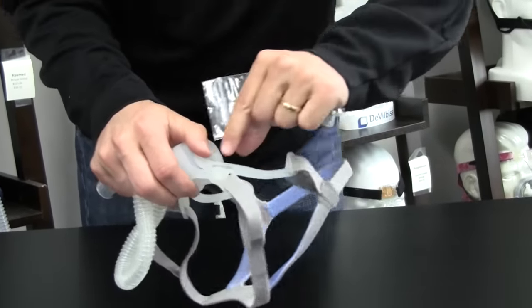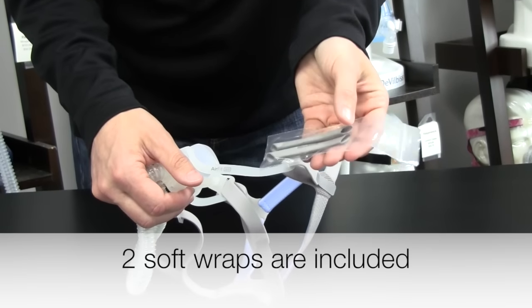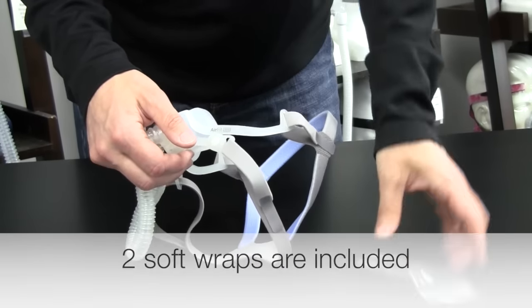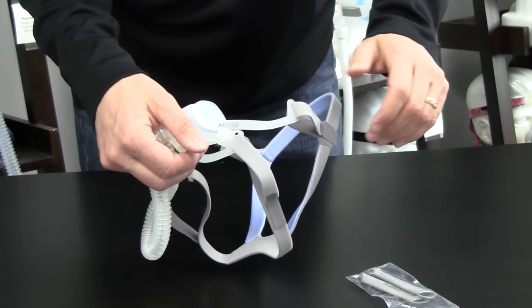They also include, since this is a pliable plastic right here, these little straps. This comes with the mask, these little cushions, and they fit right over here. That way you won't get lines on your face. It helps pad the whole thing.